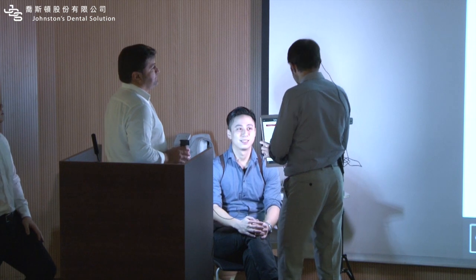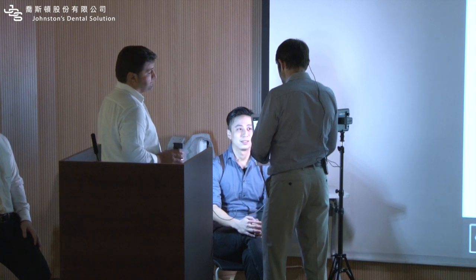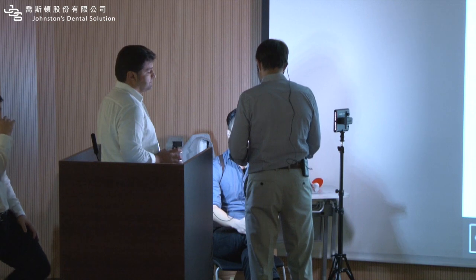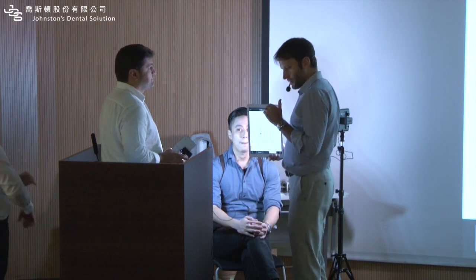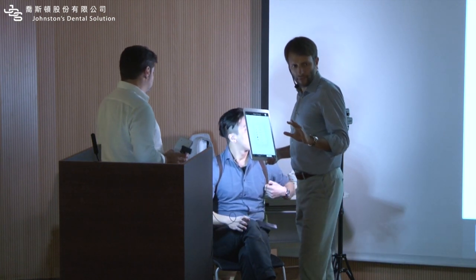Okay. So I click on frontal facial, and I'm going to take the photo. Now, actually, I'm going to show you. Below take the photo, there's select frame. Select frame is a very cool feature because sometimes it's hard to take the perfect picture, to click the perfect moment.